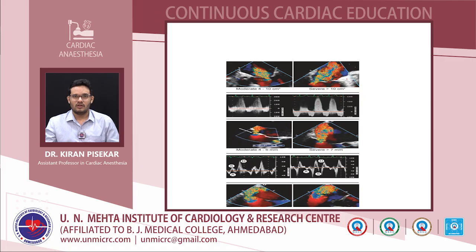This is the mitral valve, which is showing the regurgitation jet. So this is a mitral regurgitation jet, and we put the continuous wave Doppler. This is a continuous wave Doppler sample of the mitral regurgitation. Here this is the slide which is showing the vena contracta. Now we can use various methods to assess the severity of the MR: based on the continuous wave Doppler, the gradient, the maximum velocity, the vena contracta, and this is the image showing the PISA, the proximal isovelocity surface area.